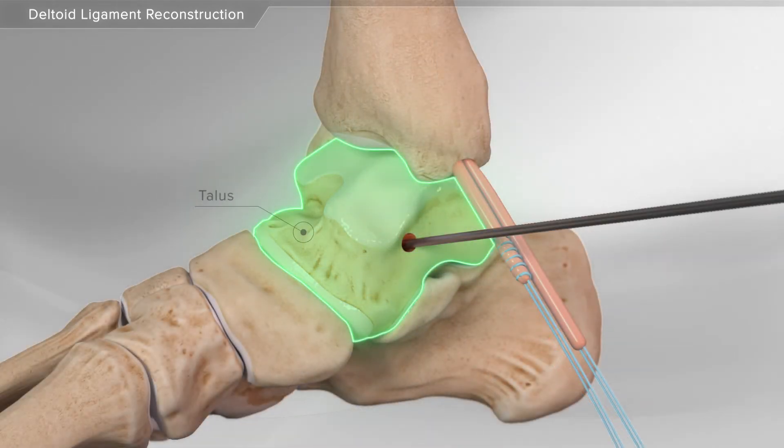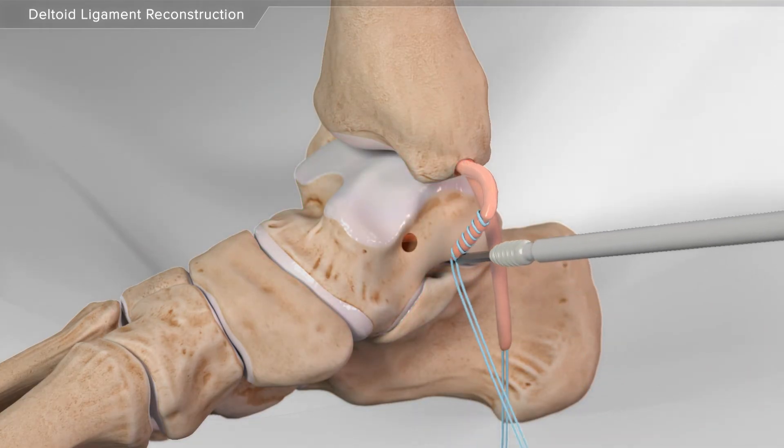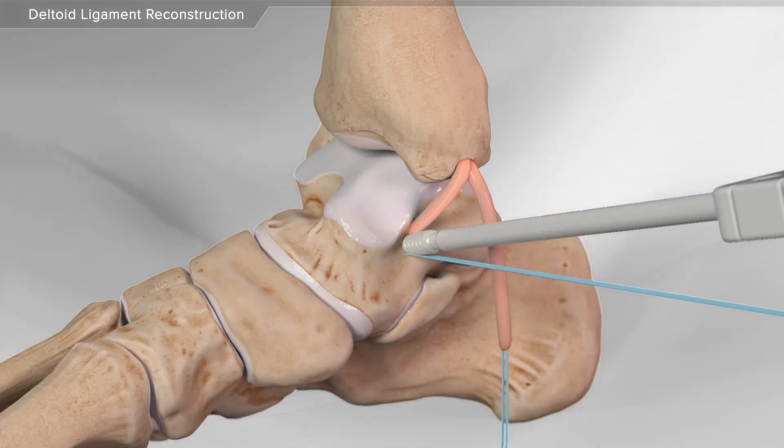Next, your surgeon makes a tunnel in the talus bone. Then, one end of the donor graft is placed through a swivel lock anchor and secured into place.